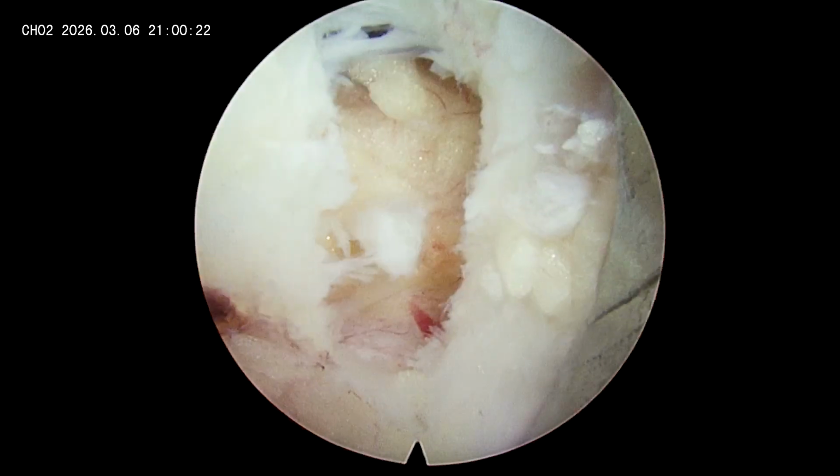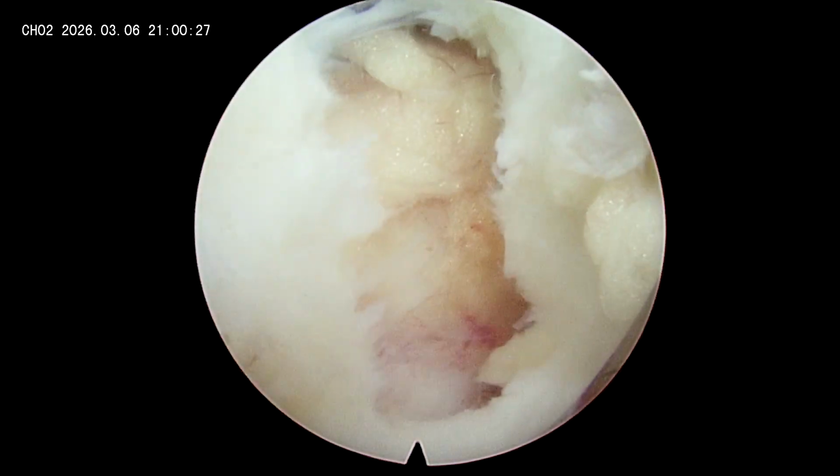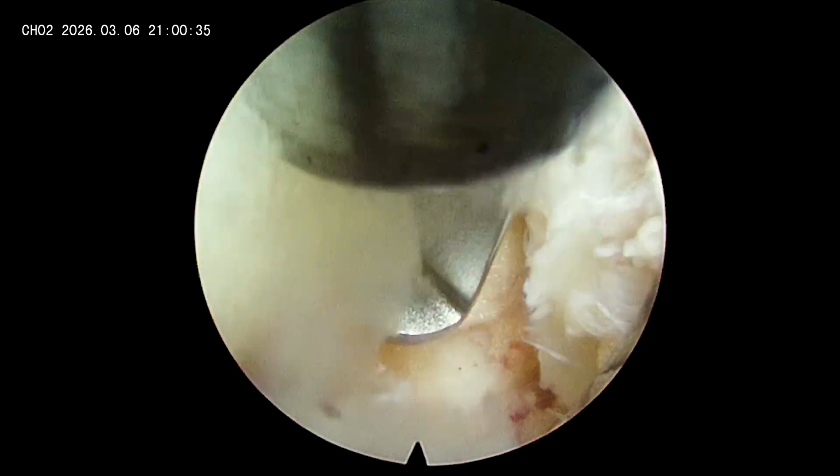Here your target is to reach the lateral aspect of the traversing nerve root. So how much ligamentum flavum you need to remove? Unless you see the lateral border of the traversing nerve root, remove the ligamentum flavum.